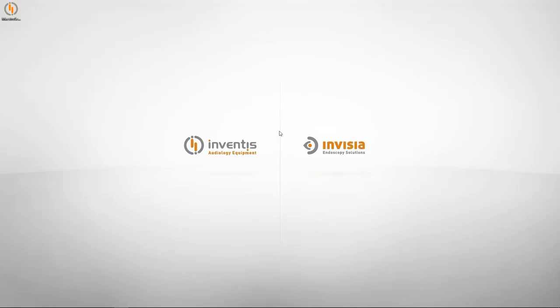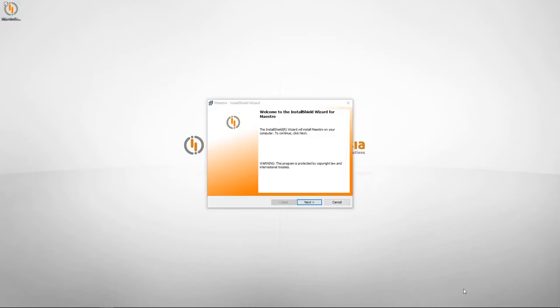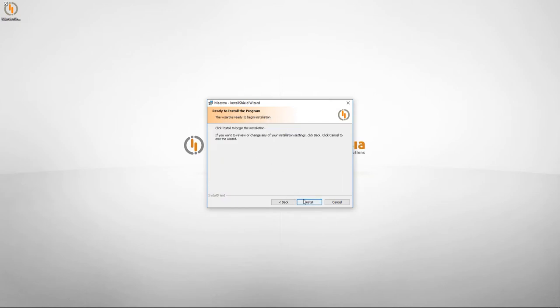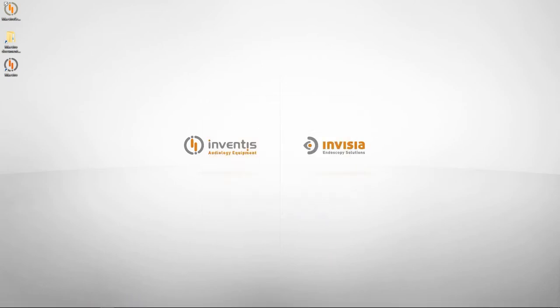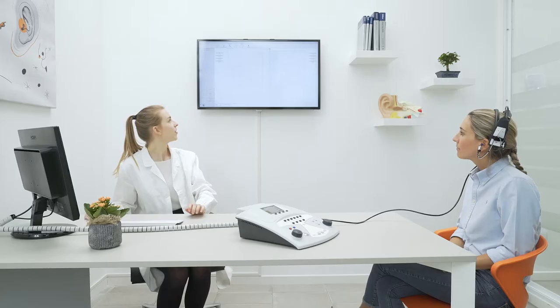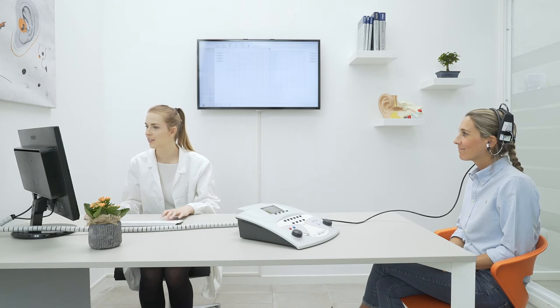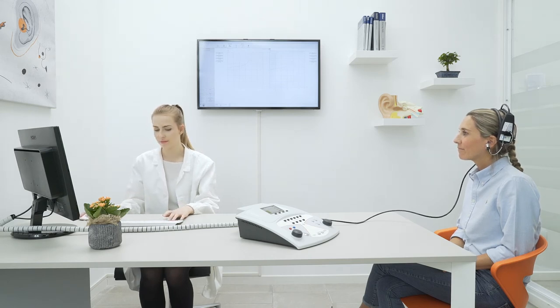Flute is controlled by Maestro Software, which is entirely developed by Inventis and compatible with NOAA. Now we can have a quick look at the software installation procedure. Double click on the installer to run the application, confirm all the settings, and then press install. Once the installation has finished, connect Flute and start Maestro by double clicking on the icon. The live view functionality of Maestro can be used to follow a test currently in progress on the computer screen.